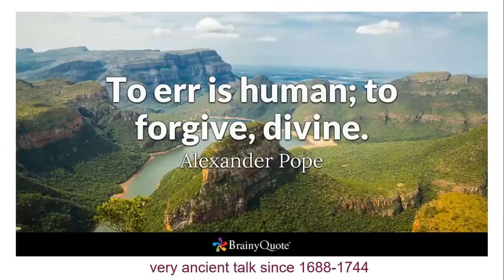Okay, definitely during your work, you have seen for yourself and for your colleagues some missing of breast cancer or other missing errors in the reporting of the imaging. But this is human. Every human work is incomplete and has shortcomings.